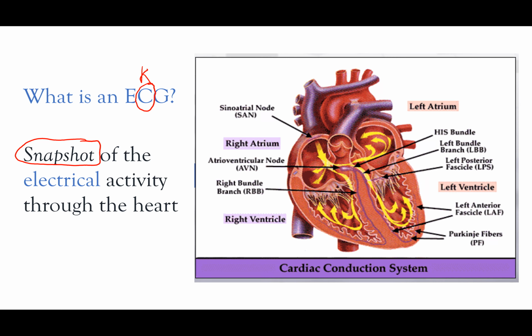So just a little clinical pearl for you. If you're working in a hospital or in the ER on the wards, and the patient came in with chest pain, by the time you got the EKG, the chest pain was gone and you got a normal ECG, don't be afraid to get another one if the patient gets pain again.